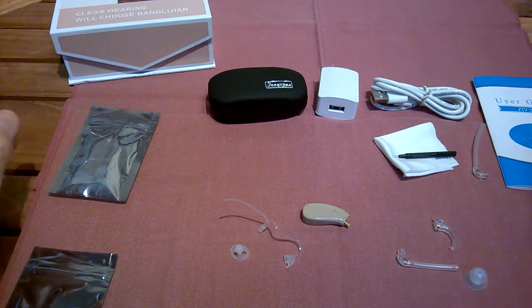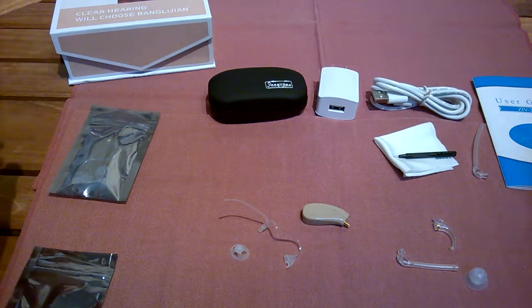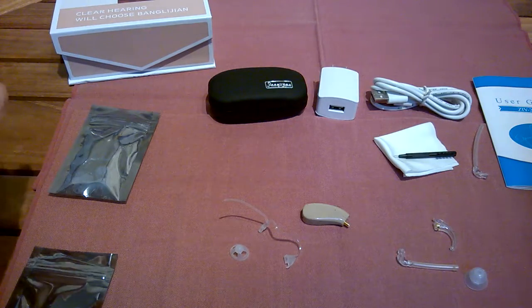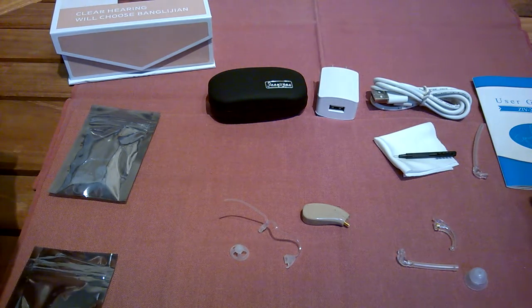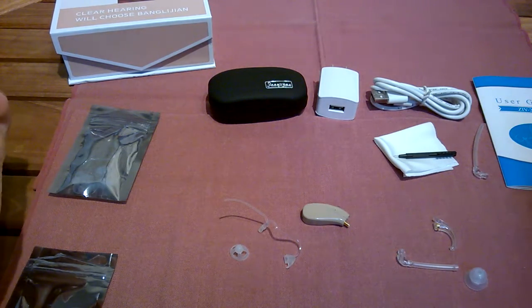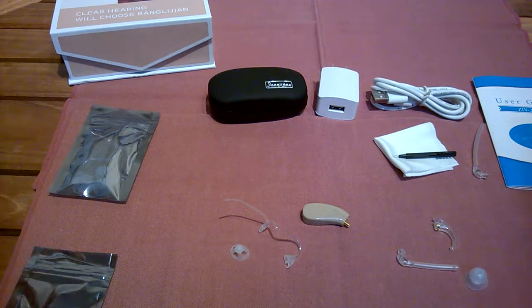Now, they're not hearing aids that cost three, four, $5,000. These are hearing amplifiers that, for the most part, will increase volume and also add a little bit of hearing help with the upper register. They're pretty well programmed for the higher register, which is what most men usually lose. Anyway, so I came across these.